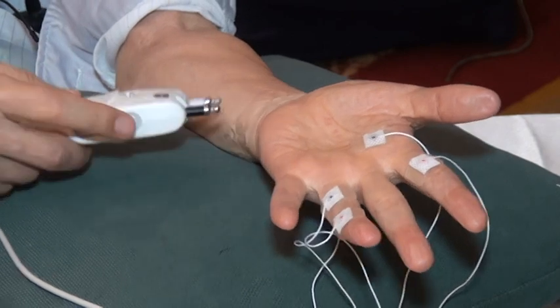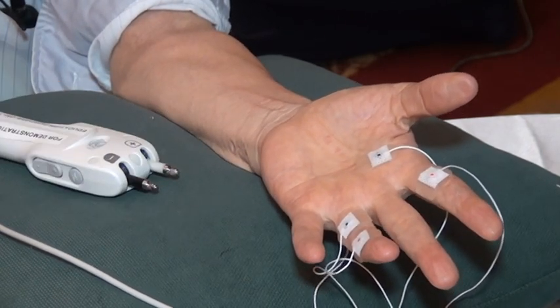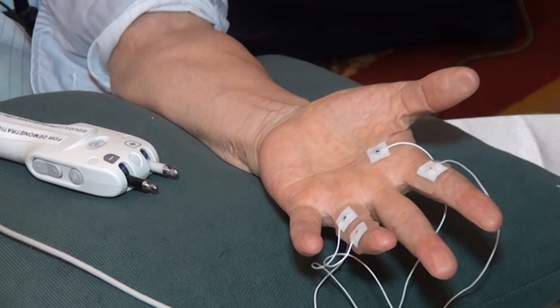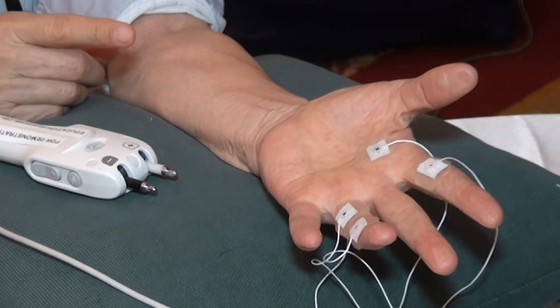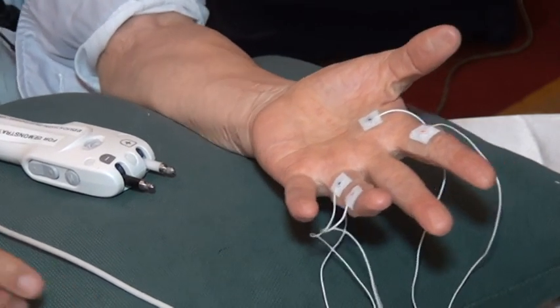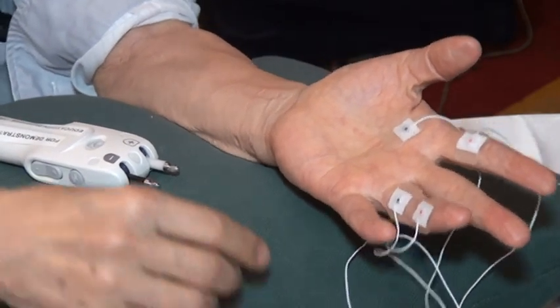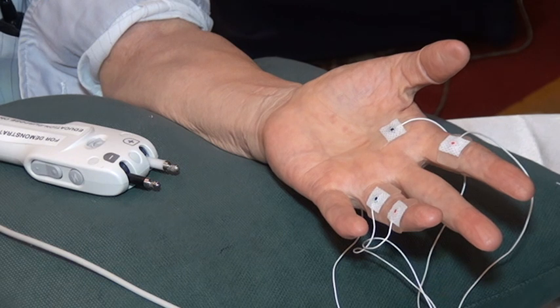Like that, right? Okay, and you compare the latency. And again, anything more than 0.5 milliseconds is abnormal here. All right, and this is a very good way to do it. Now I have a question here for you. This is my median response, right? And this is the takeoff.